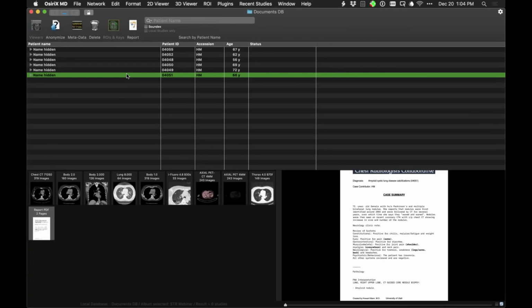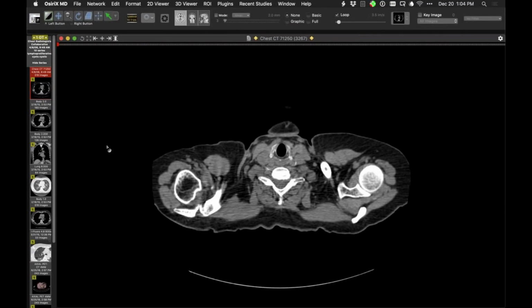A couple of keywords will definitely summarize my cases today. Cysts, lymphocytes, plasma cells, protein. So here is a first patient.